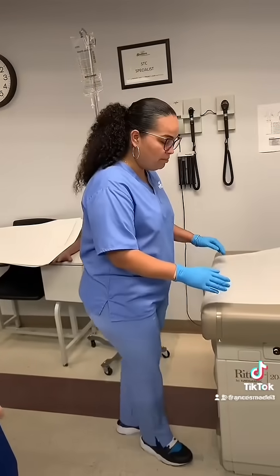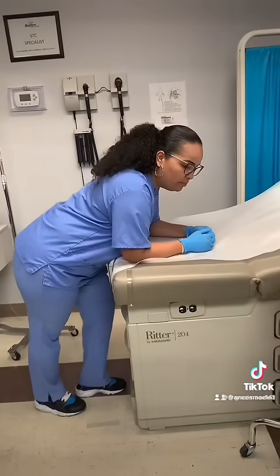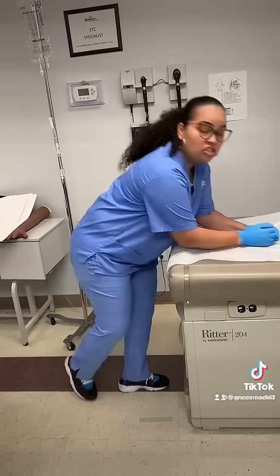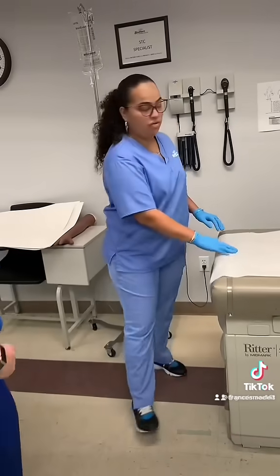Typically I tell my patient to go ahead and lean like this over the bed. And if we're going on the right side, you're going to take off all the weight from that right side.